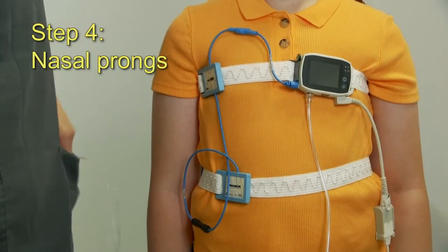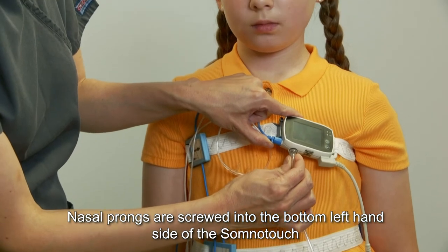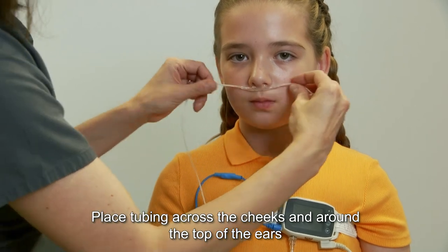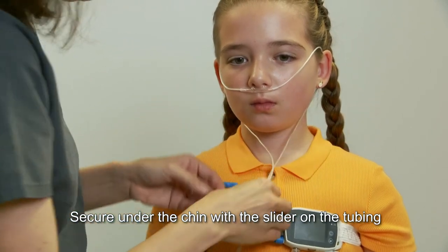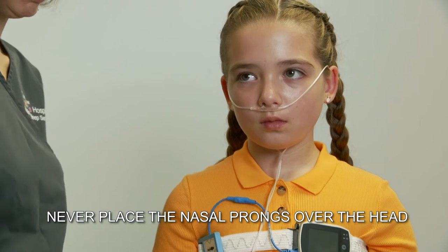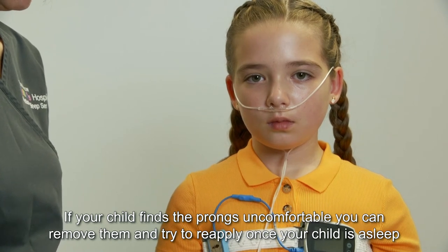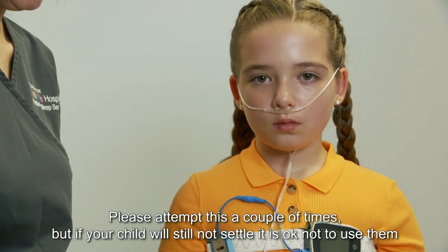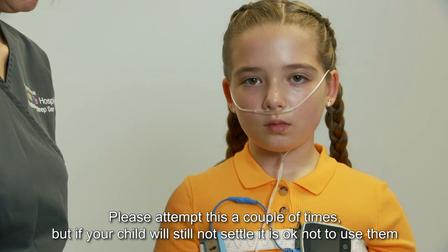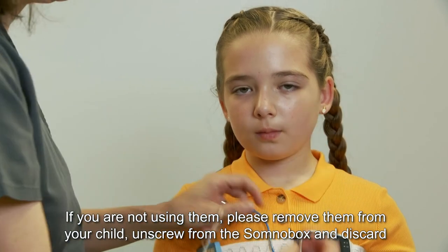Step four: nasal prongs. Nasal prongs are screwed into the bottom left hand side of the SomnoTouch. Position the prongs at the base of the nostril. Place tubing across the cheeks, around the top of the ears, and secure under the chin with a slider on the tubing. Never place the prongs over the head. If your child finds the prongs are uncomfortable, you can remove them and try to reapply once your child is asleep. Please attempt this a couple of times, but if your child will still not settle, it is okay not to use them. If you are not using them, please remove them from your child, unscrew from the SomnoTouch box, and discard.